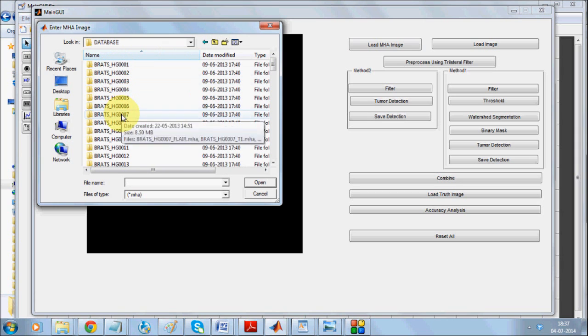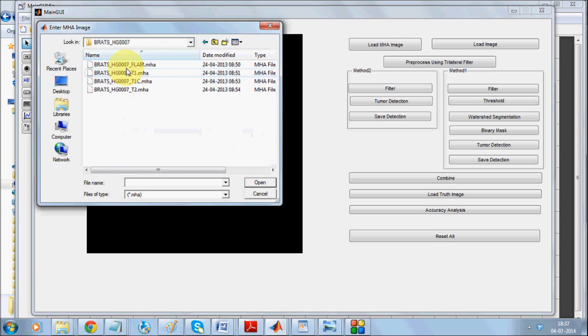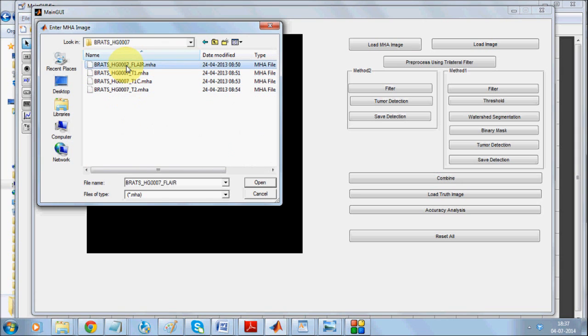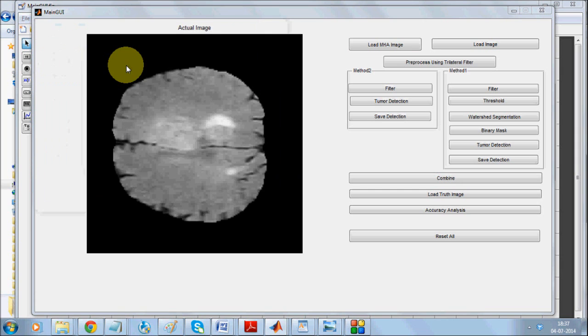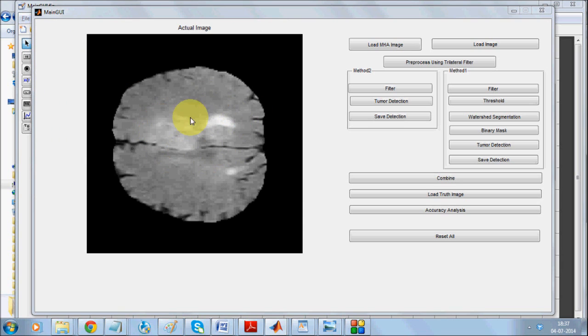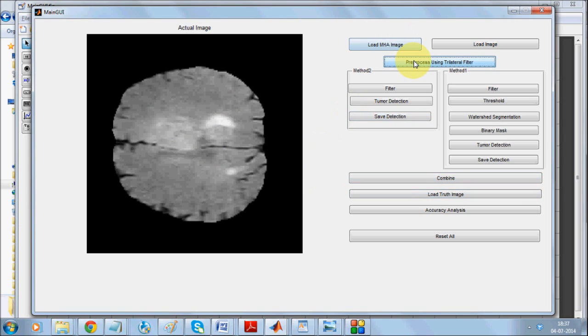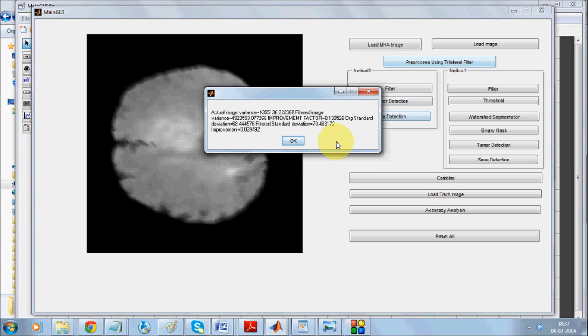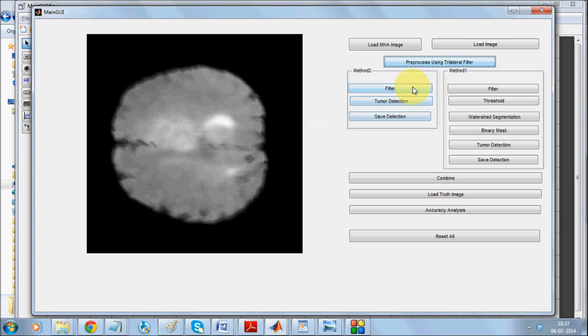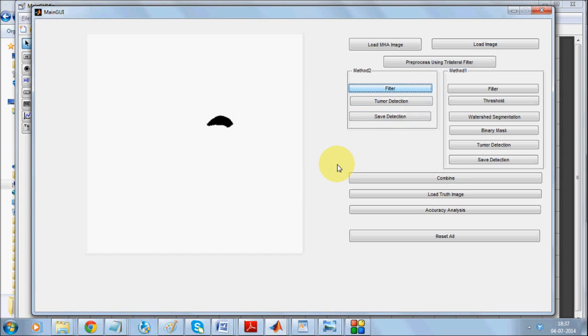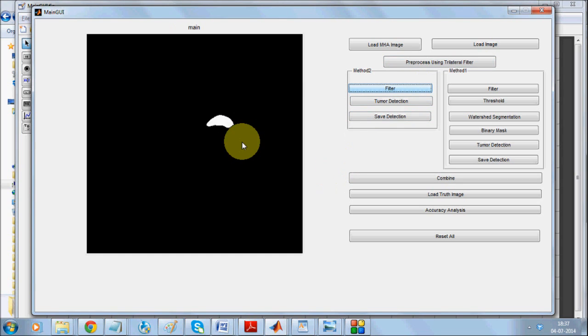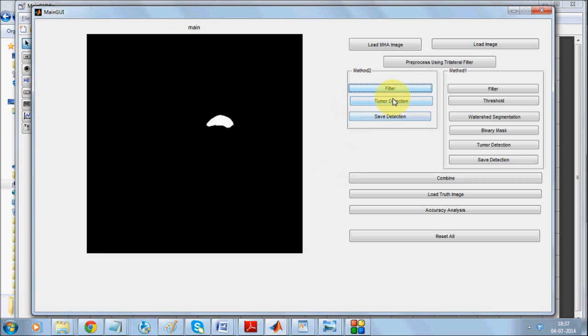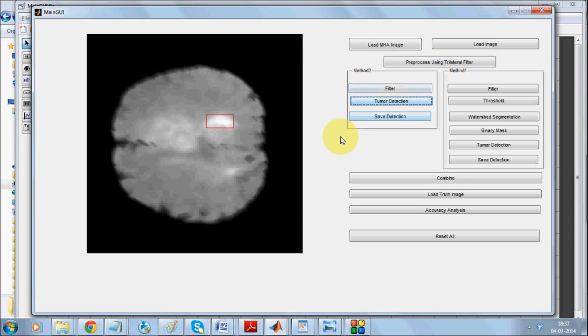This is the seventh image. It is detecting the whole area over here. Now preprocess and apply EM-based technique which returns only this part. Nonetheless, detect the tumor and save it.